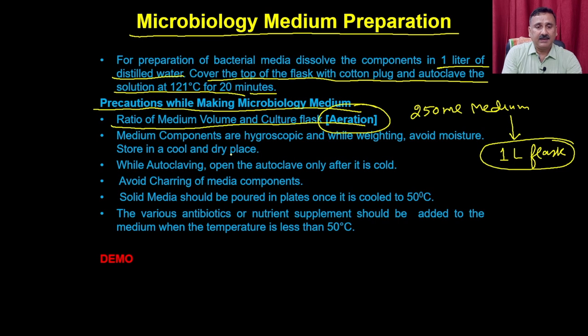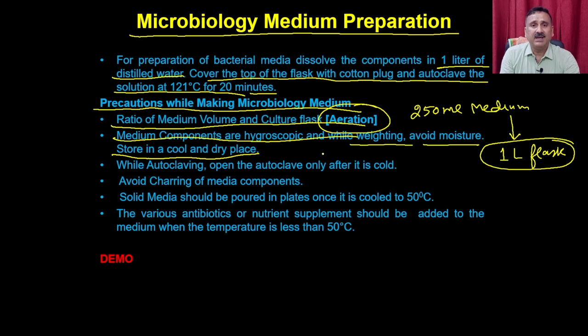Then you should remember that the media components are hygroscopic, so while weighing, avoid moisture, and store in a cool and dry place. You can understand that if there is moisture, then the amount of actual powder is going to be lower, because you are also weighing the water. So that is going to make the media less nutritious for the bacteria.